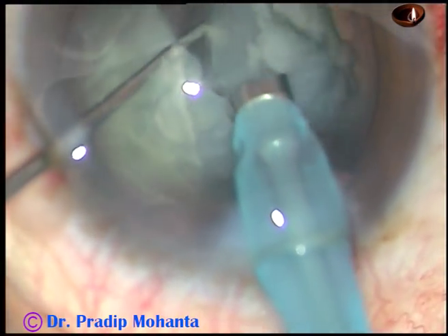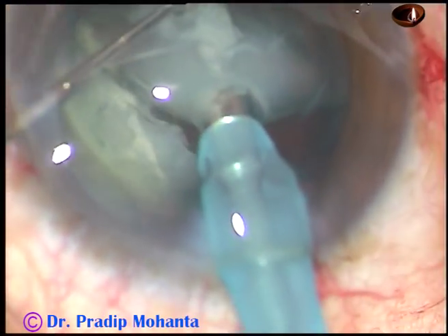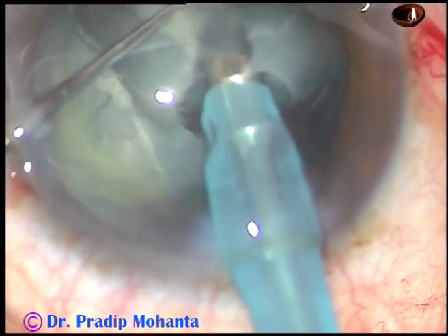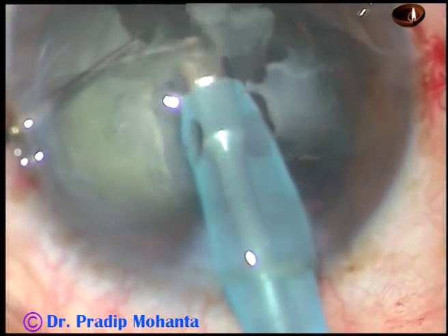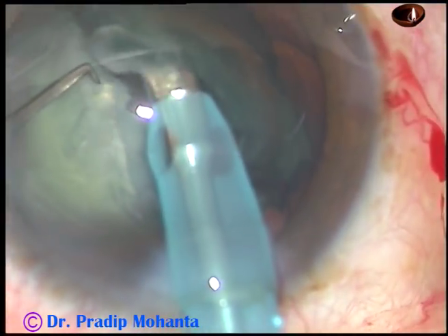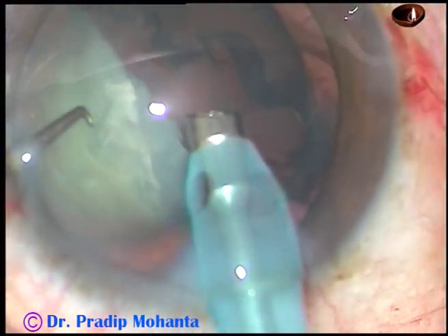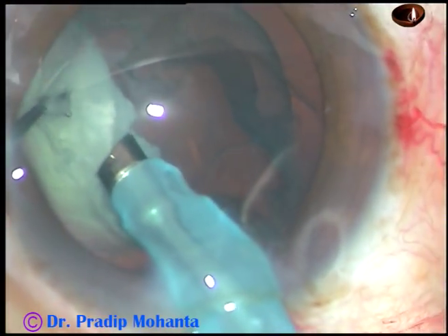I divided the nucleus into 2 halves, and the nucleus on the right side is tilted, and it is divided again into 2 parts, and then it is emulsified and removed. And see, the epinuclear shell is still there.